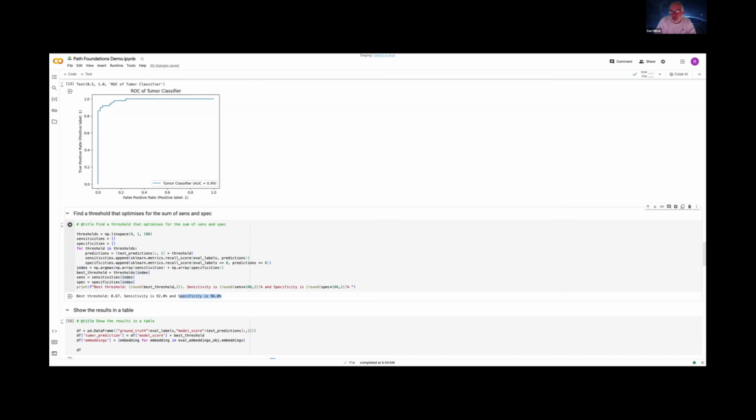Because if you are a general pathology lab, like all of our participants today are going to come from general pathology labs, you have your first slide's of lungs, next slide's of breast, third slide's of prostate, fourth slide's of lung, fifth slide's of colon. And to truly change the way that someone's practice, to be disruptive to their practice, you have to think about what does their workflow look like and how could AI really affect that.